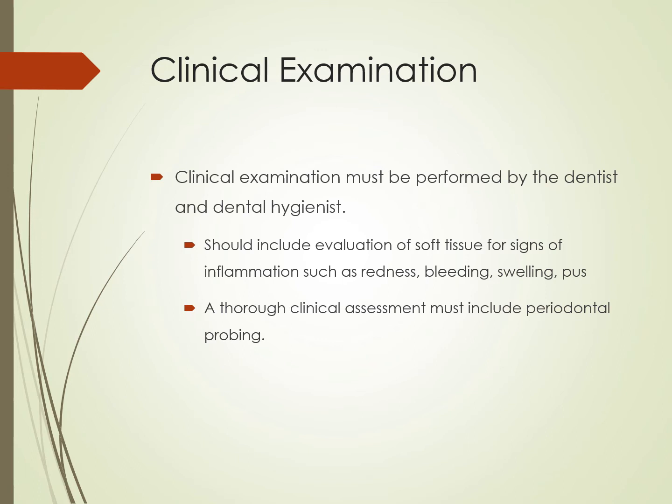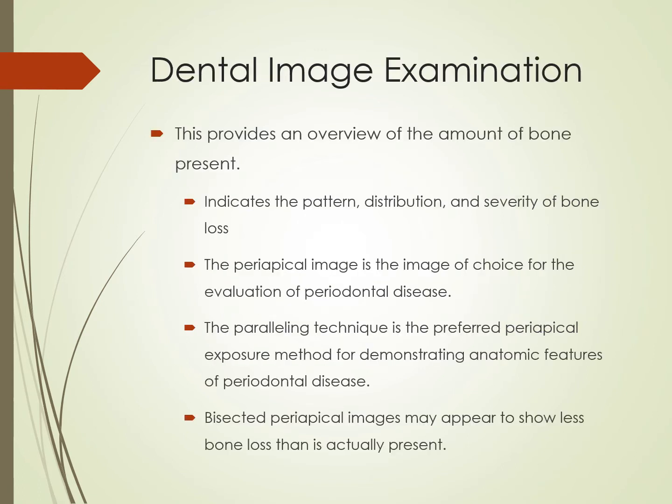And so it happens to you. And as you learn, as you grow, you'll learn to use those radiographs and the charting together. Okay, so this dental image examination, this is talking about which series of x-rays we would take, right? That examination is how many x-rays we take.